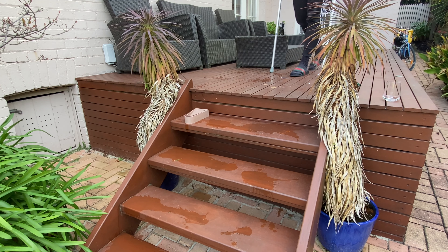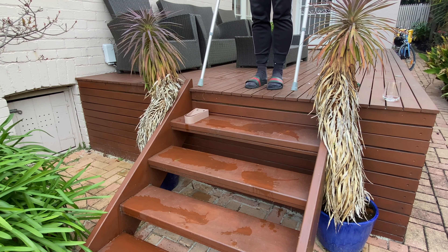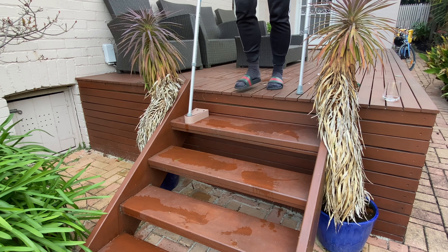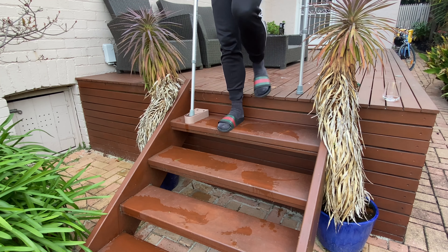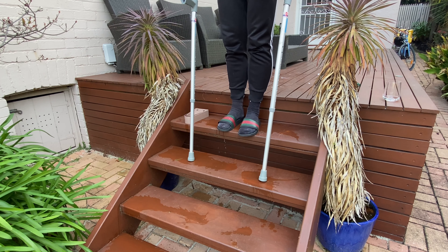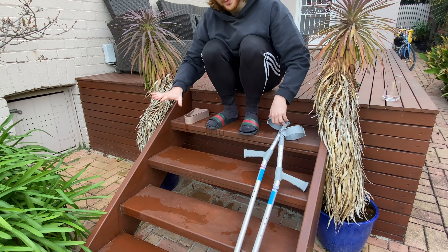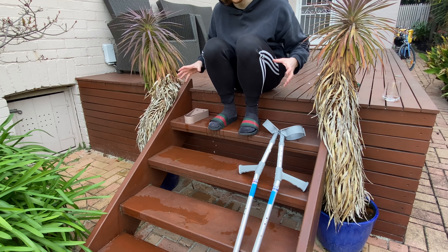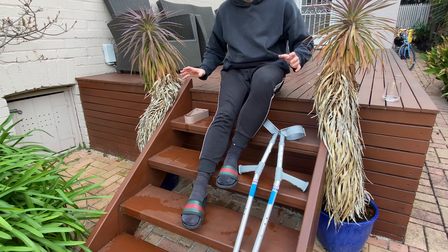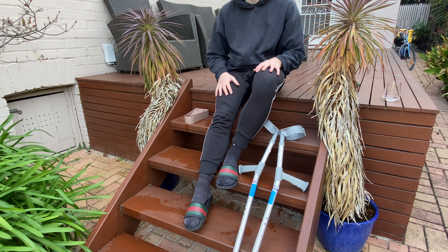In a real situation, the user will approach the steps, see that it's wet, but that's no problem because they can go into the device, securely put their weight on, and take the step down, then remove and proceed down. Ideally, there would be eight units in total — two on each step and to each side — so they're not in the way of people using the steps normally, and are just off to the side for when the user needs them. And that's the crutch anchor.